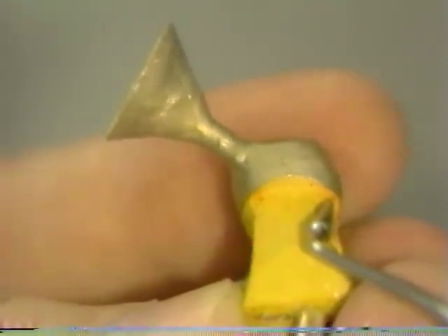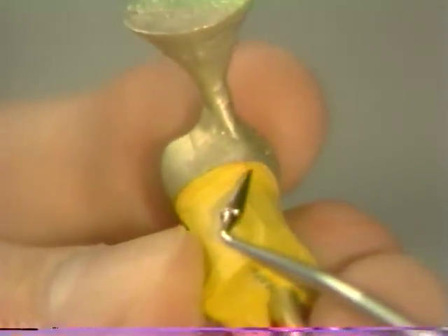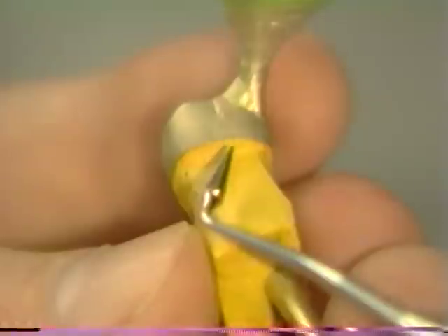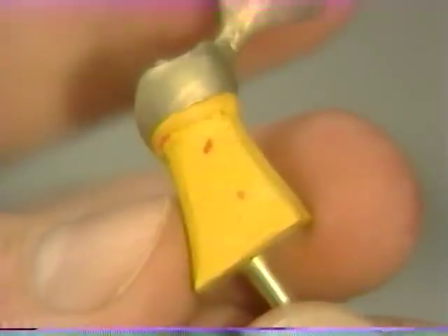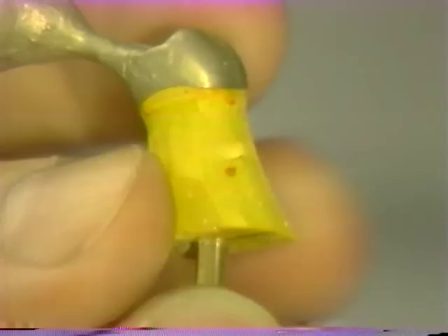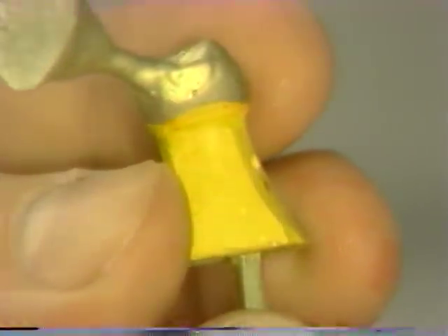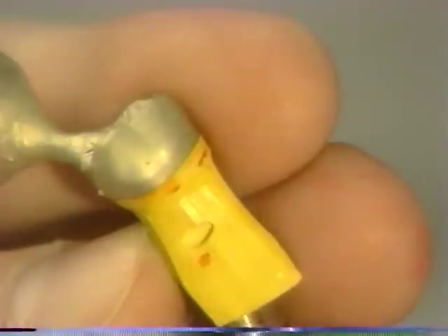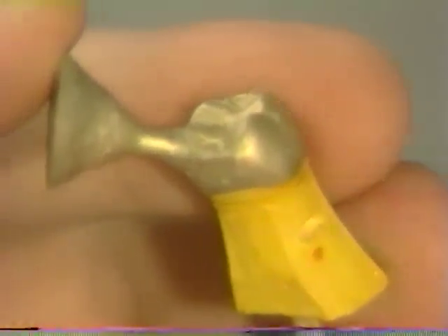Once the casting is fully seated, it is inspected for marginal integrity as well as stability on the die. No discrepancy should be present at the junction between casting and die circumferentially — no shadow line should be visible. If a gap is present, either the casting is not fully seated or the pattern was warped at the wax-up stage and the procedure needs to be repeated. Once satisfied that the fit is acceptable, the button can be removed.